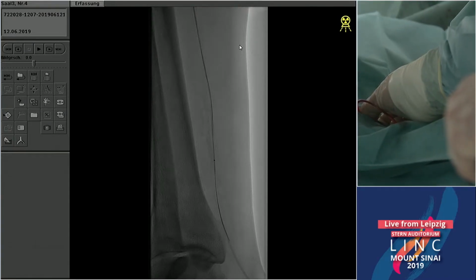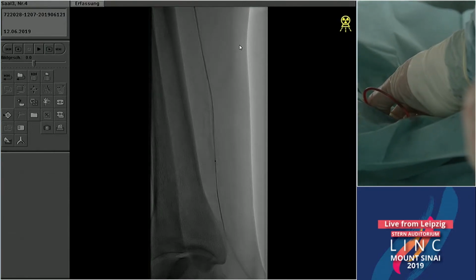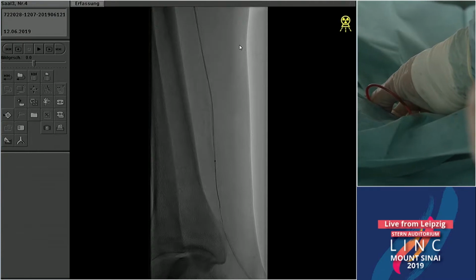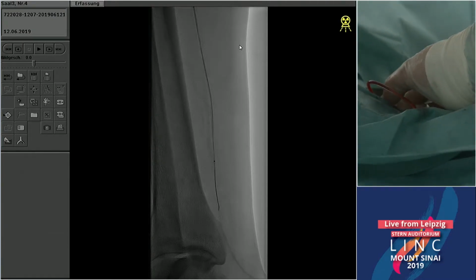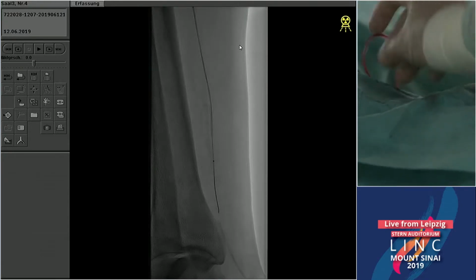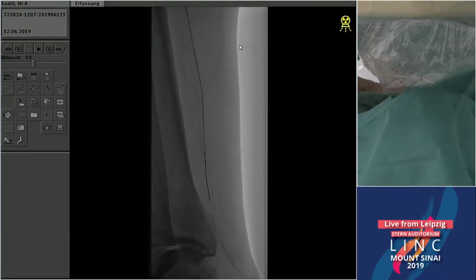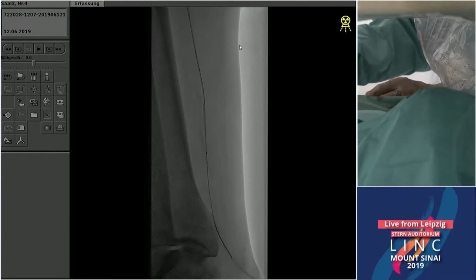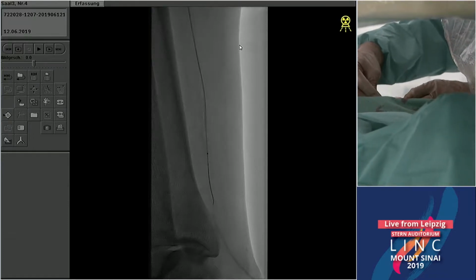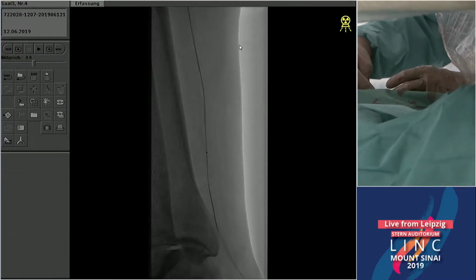More. Yeah, I guess we just have to pull it out. Sometimes a lot of spasm, even more, I think. Just pull more. It's not far in anymore. No, I think you have to pull a little more. It doesn't matter if it drops out. Okay. I mean, of course, we can also save this step for later.